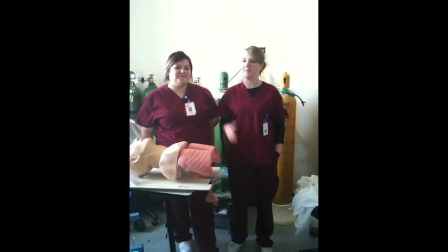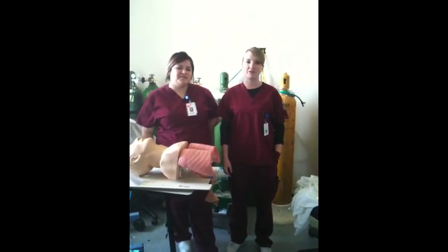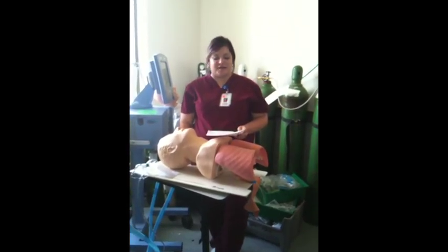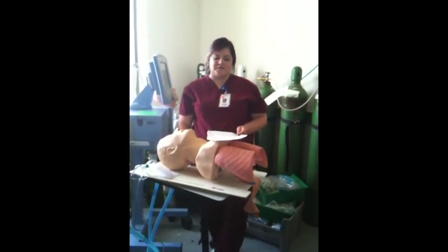My name is Lisa. Hi, my name is Gary Lynn, and we are doing nasotracheal suctioning. To NT suction a patient, there are several steps that you have to follow.